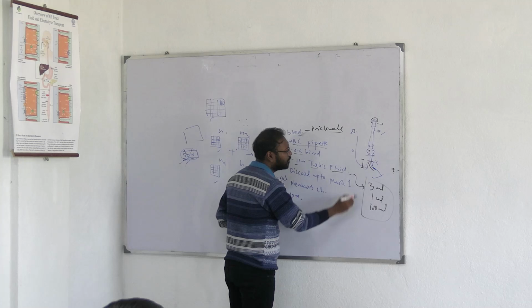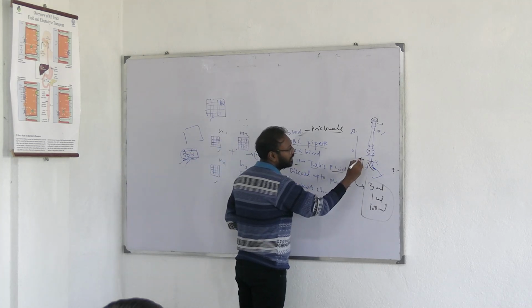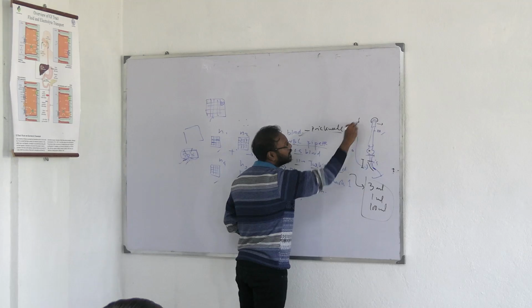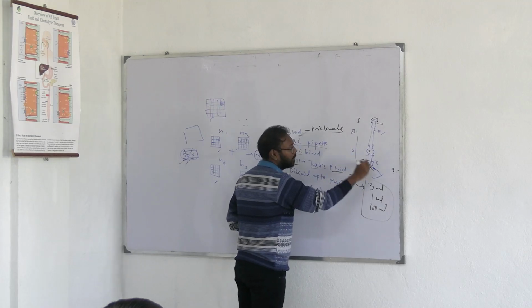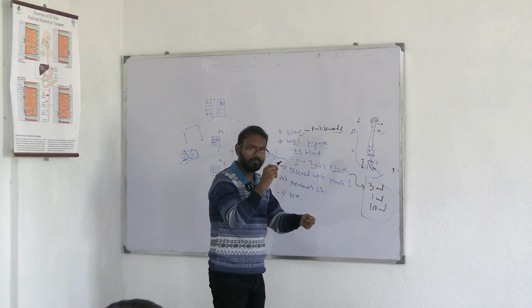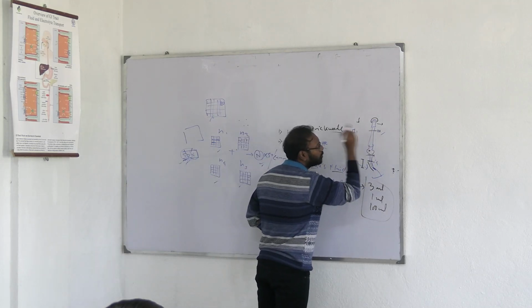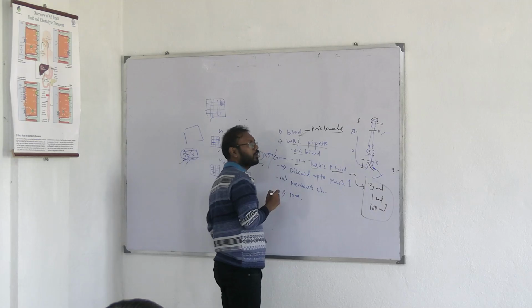Then you have to take this Turk's fluid up to the mark 11. So first you have taken the blood. Now you will start again from here. Now capillary action will not work because this capillary is already blocked. So now you have to actively suck it. You will actively suck and take it up to 11. That means up to this point, you have to take it.